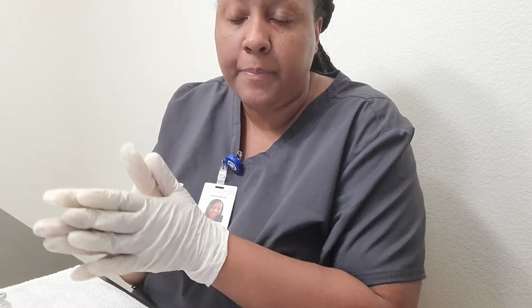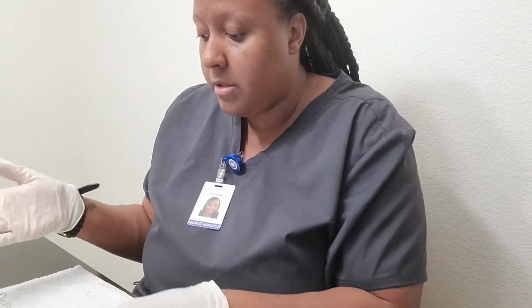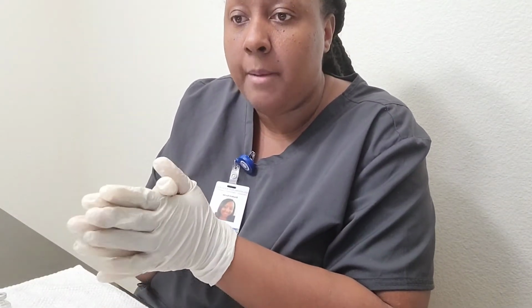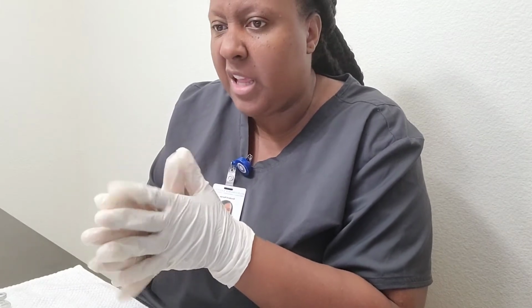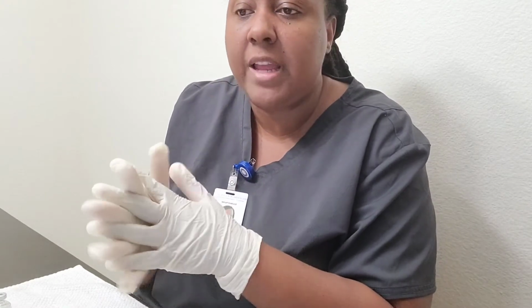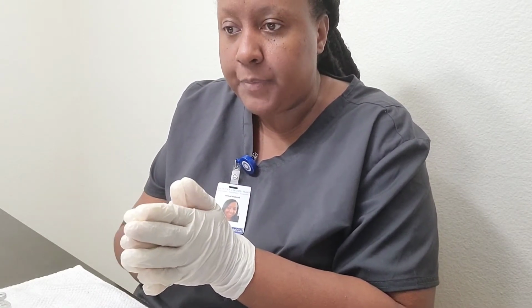And if it was refrigerated, I would allow it to come to room temperature. This has been at room temperature. Since I was expecting insulin, I would look for any clumping or frosting, or any alteration in coloration. I will check that.